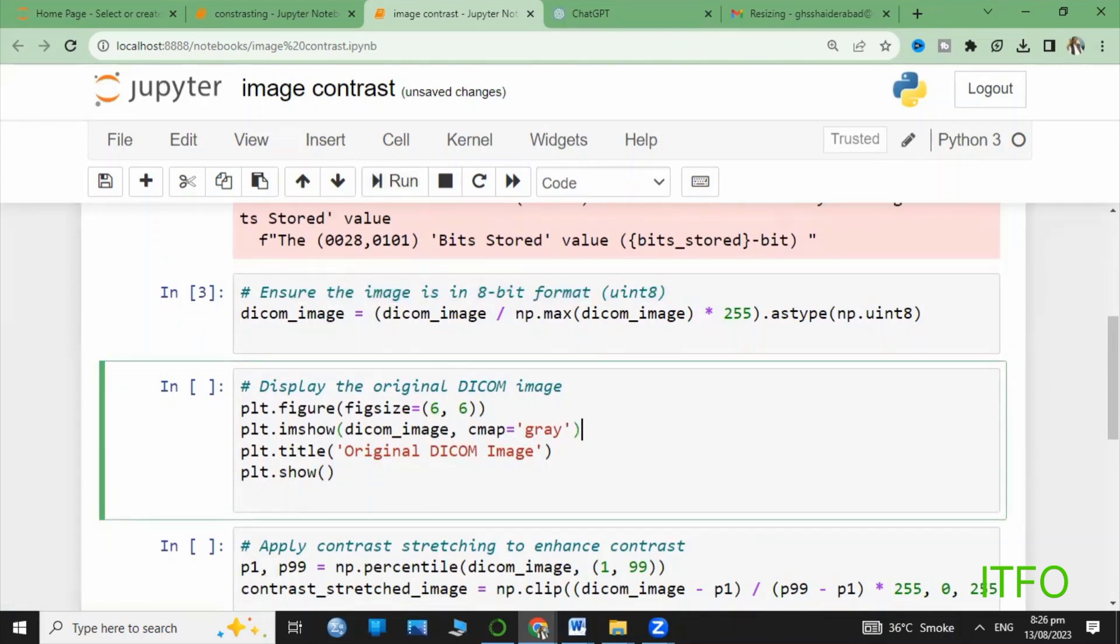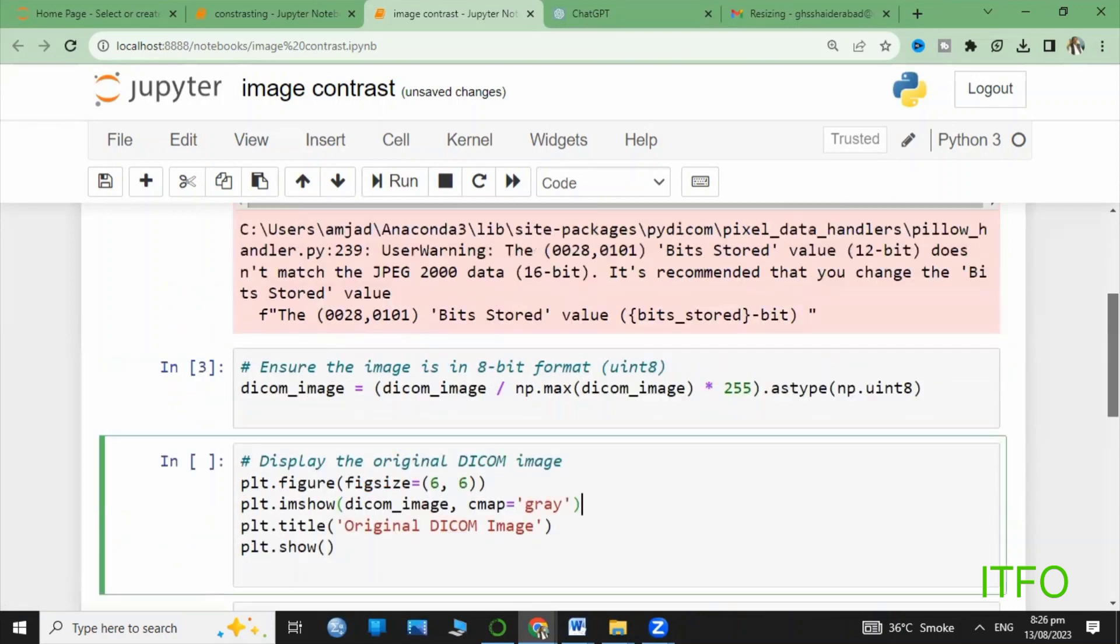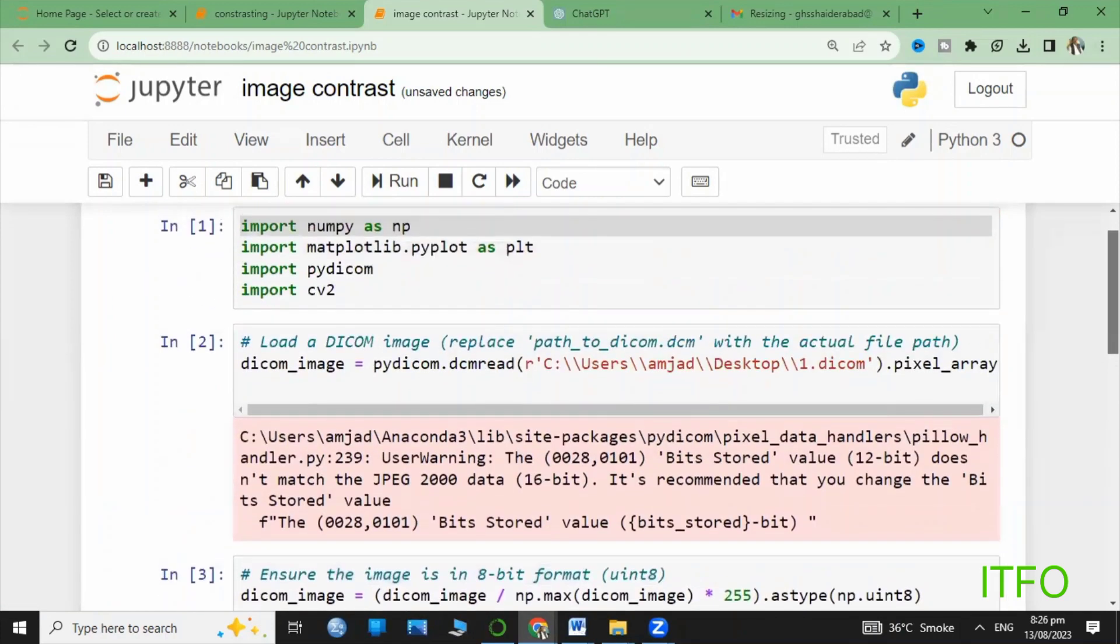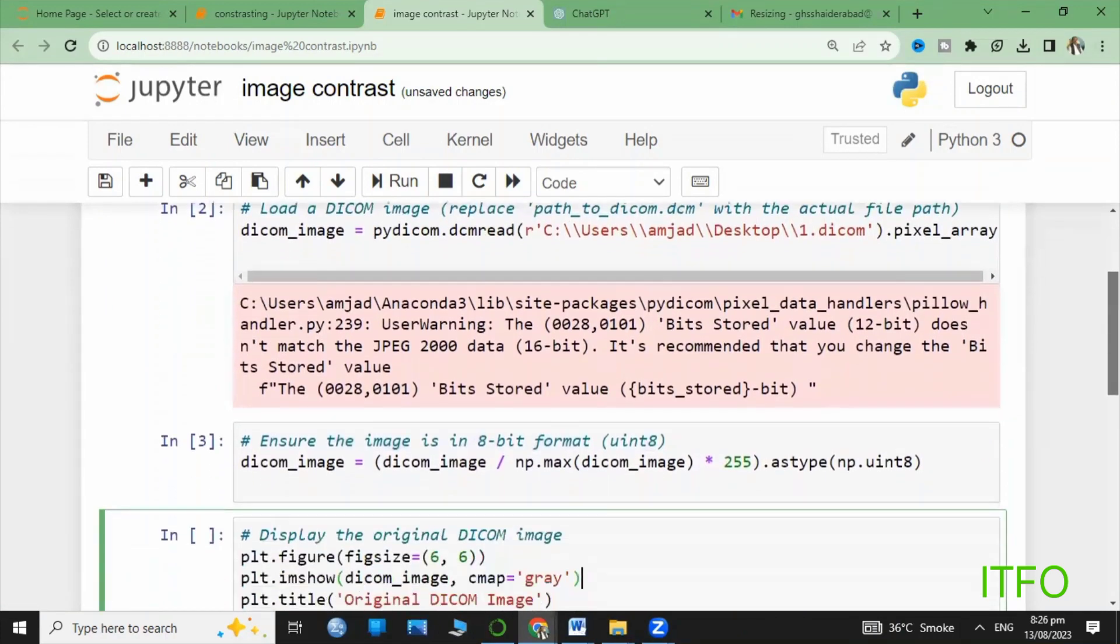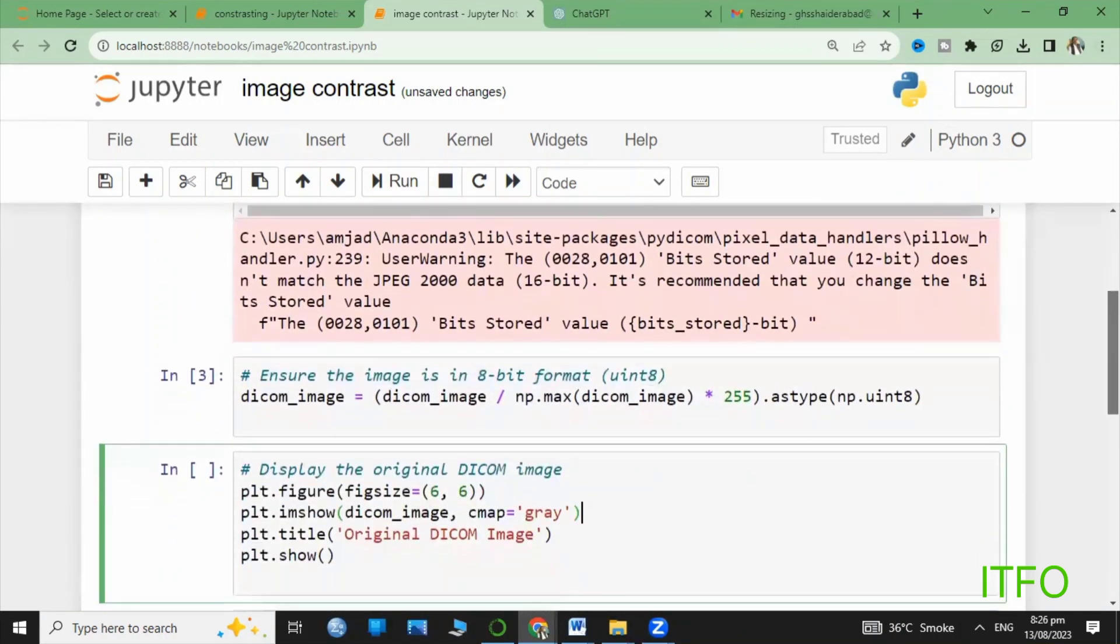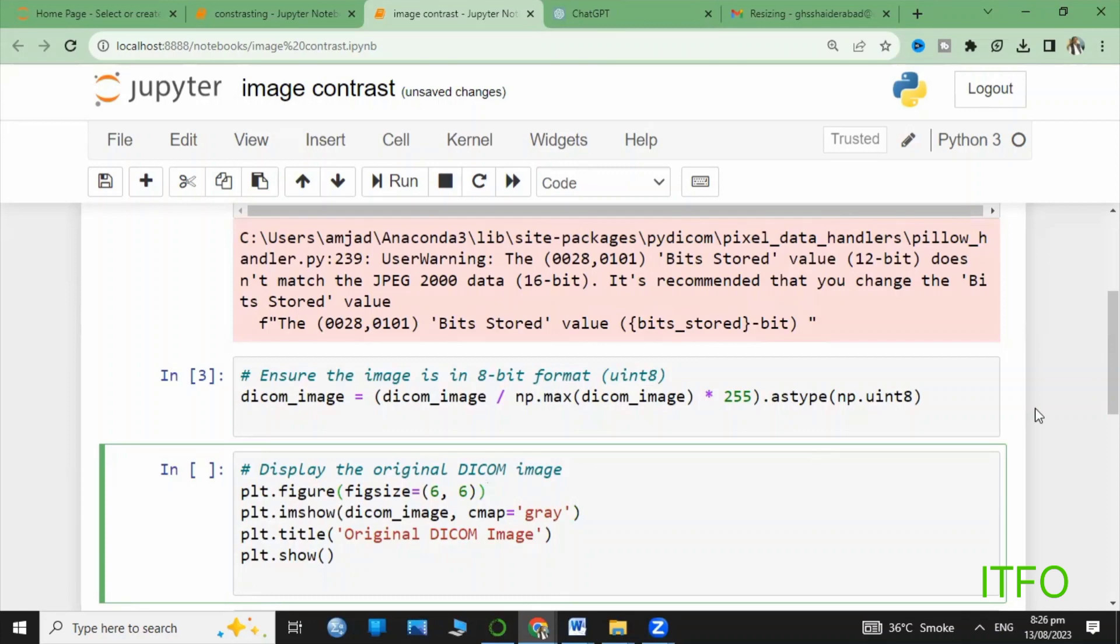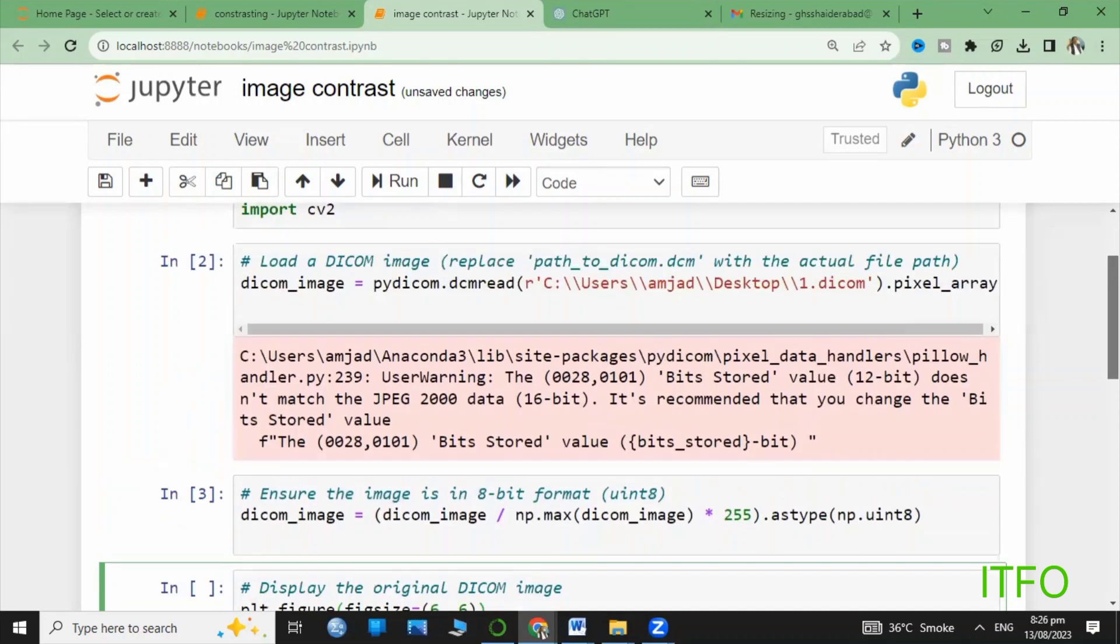Now we're going to apply the contrast stretching strategy. Let's enhance the image contrast using a technique called contrast stretching.